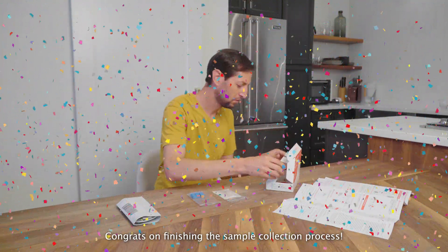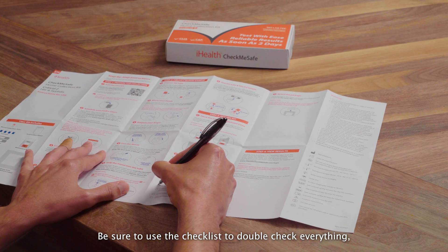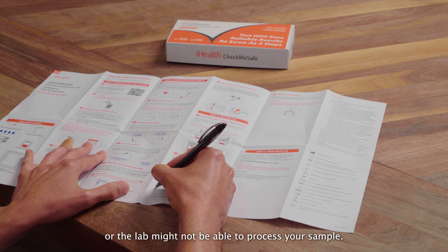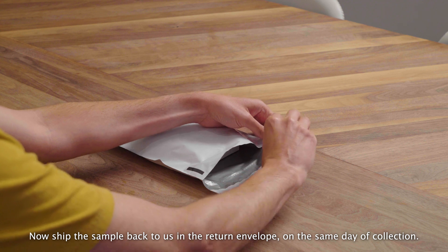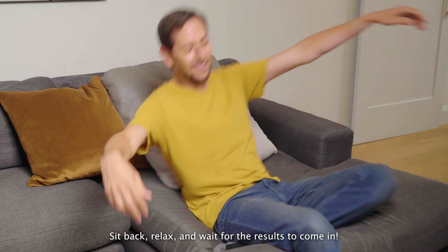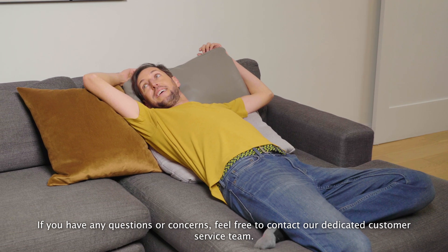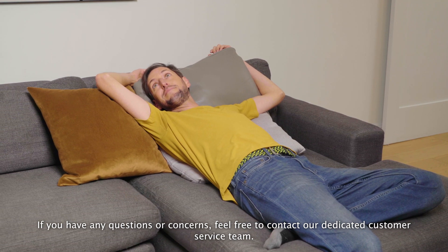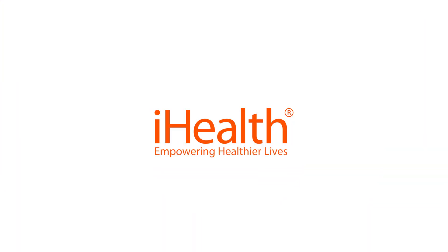Congrats on finishing the sample collection process. Be sure to use the checklist to double-check everything, or the lab might not be able to process your sample. Now, ship the sample back to us in the return envelope on the same day of collection. Sit back, relax, and wait for the results to come in. If you have any questions or concerns, feel free to contact our dedicated customer service team. iHealth — empowering healthier lives.